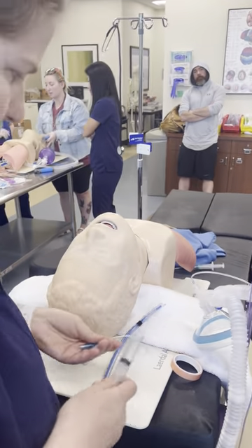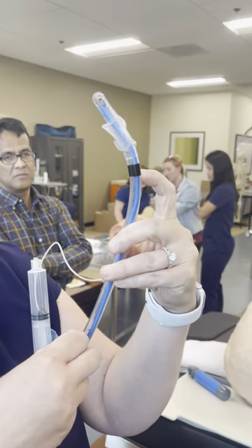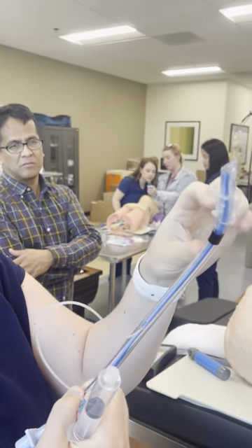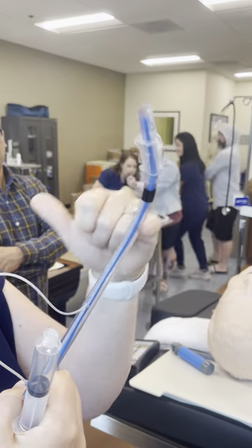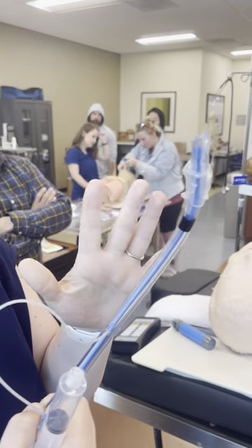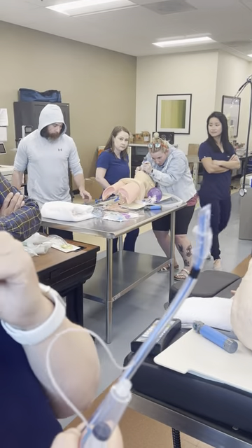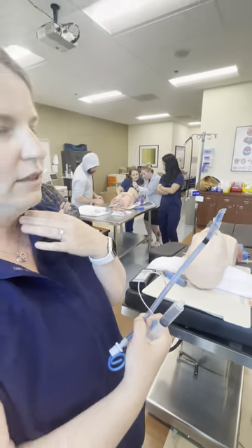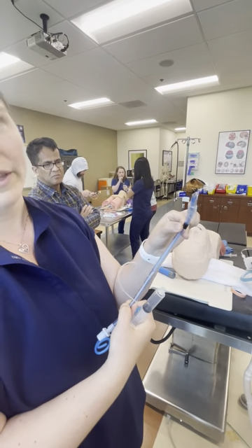The black line on the tube has to be past the vocal cords — you want the cords right on the black. On some tubes you'll see two thinner black lines, and you want the cords between those two lines. However, always verify your tube placement, because if somebody has a very short neck, the distance between the larynx and the carina is very short, so you can't always go by the manufacturer's guidelines.